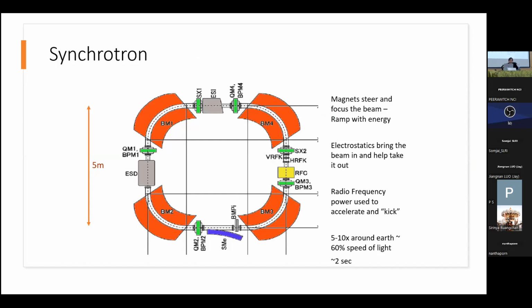So this is a schematic of a 4-quadrupole synchrotron. This is kind of a cartoon of, let's say, the Hitachi system. The system you guys look at is similar. I think it has 7 quadrupoles, if I'm not mistaken. But anyways, the injector we just saw injects into this part right here, into this electrostatic injection system. Just like anything else, these particles are coming in from one accelerator, and now they have to meet the other accelerator, and they have to be well tuned together in order to get the most efficient system to treat the patient.